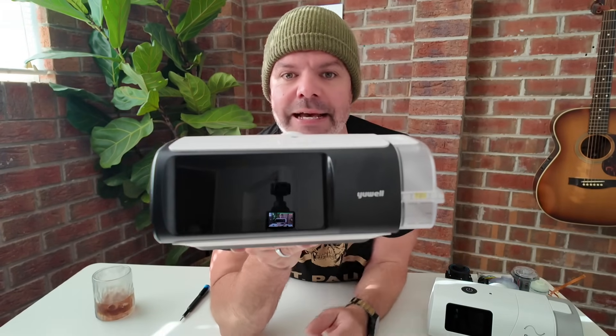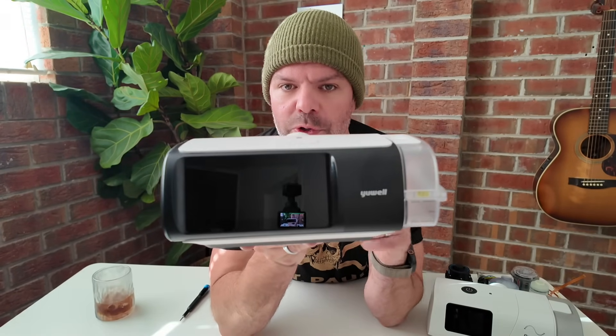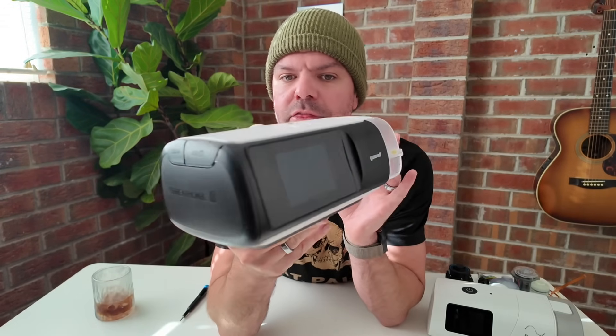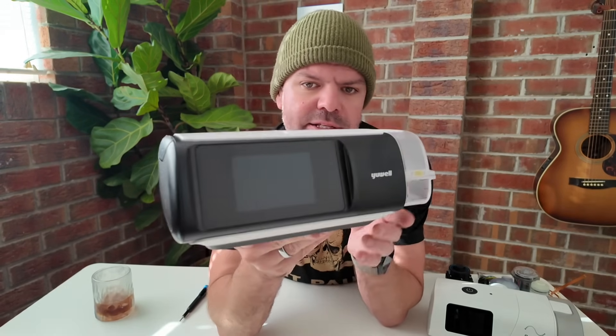G'day, mates. This device here is causing quite a stir in the industry. It is the Yuwell BreathCare 3, and you can understand why.